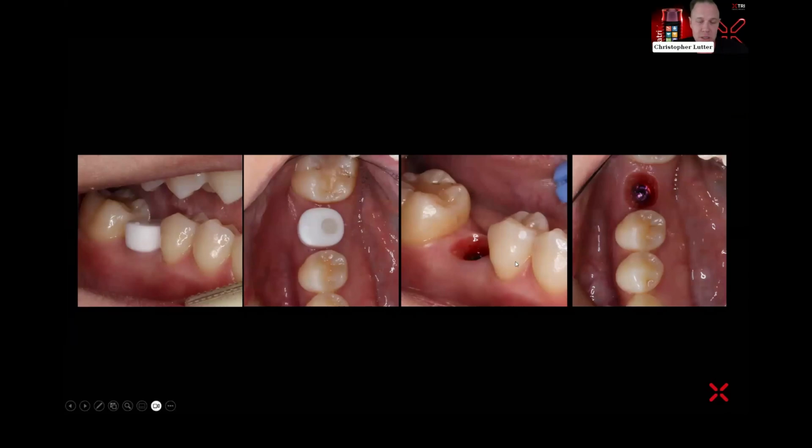But this is the way this case should look like. You can also characterize these and stain and glaze this. Coming from the implant world of almost 2 decades, I find it a little archaic that metal healing abutments are used off the shelf.